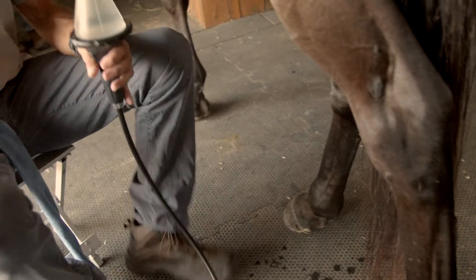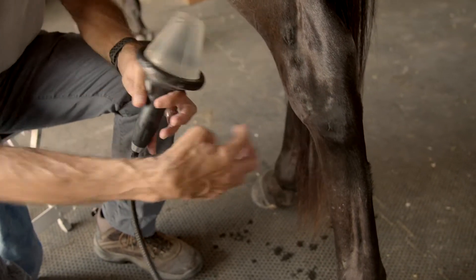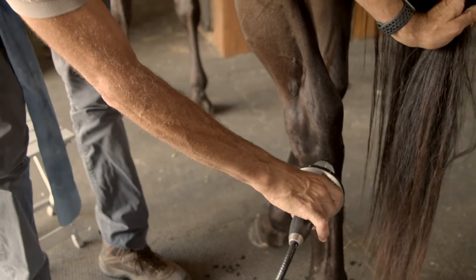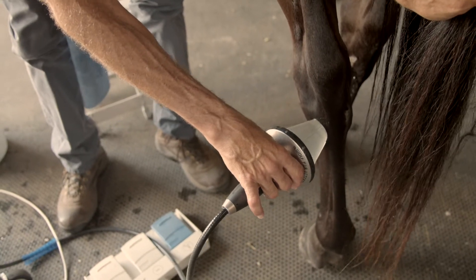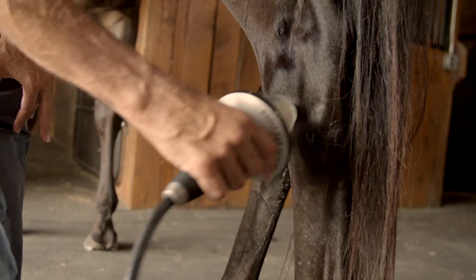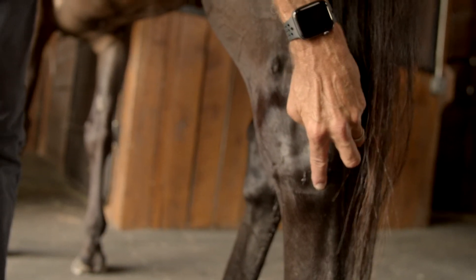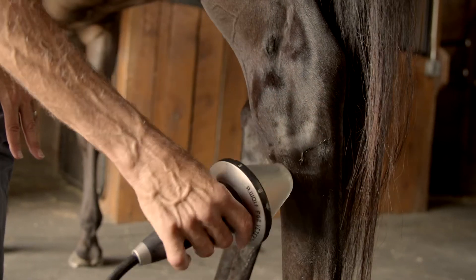Just for reference, if I was concentrating on the lower joint of the hock, I would prepare this area again with the 20 millimeter offset. I would orient the probe in this way — just like you'd orient your needle — and put 2,000 clicks there. Another access area to this particular joint where there's good contact: you can hit the front of the lower joints in this direction as well and split the clicks accordingly. When treating the lower joint, use the same landmarks — the top of the head of the splint bone in the same direction you'd inject the needle. Put the probe at 20 millimeters and hit it from two angles.